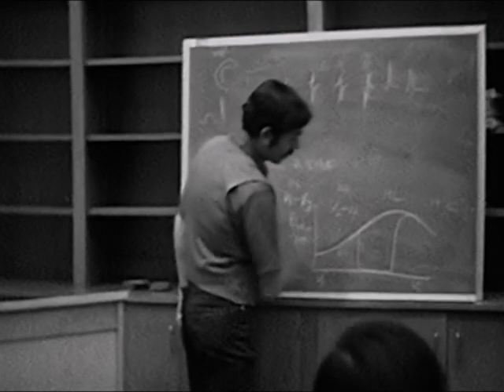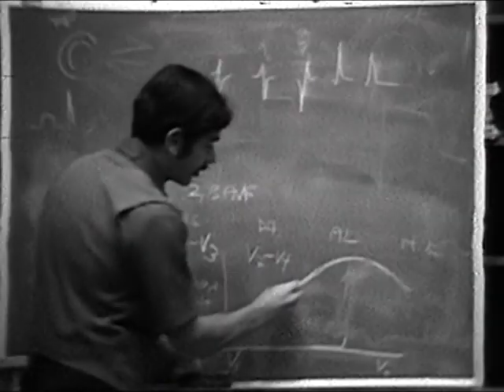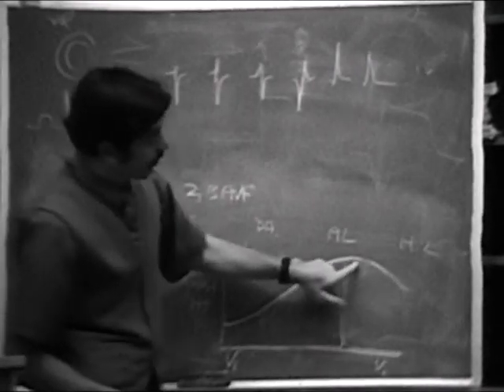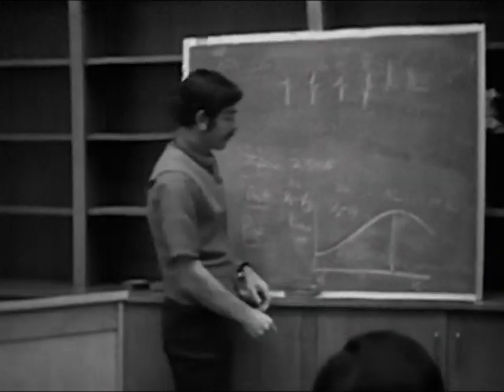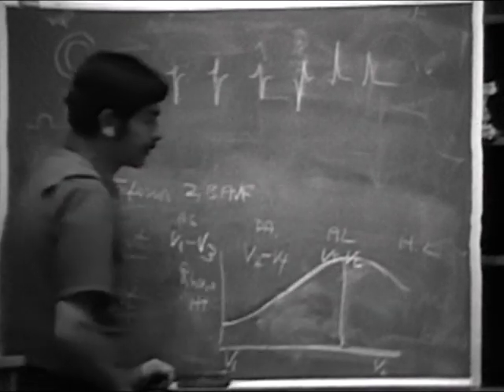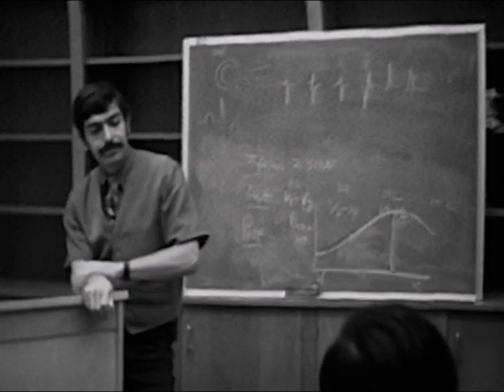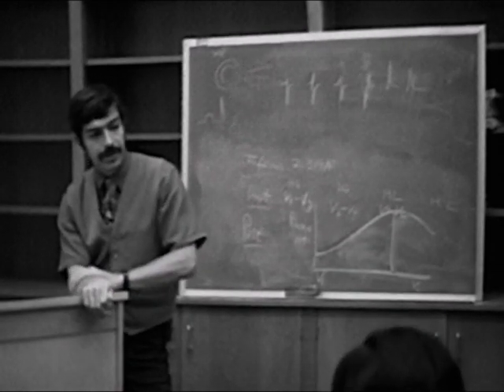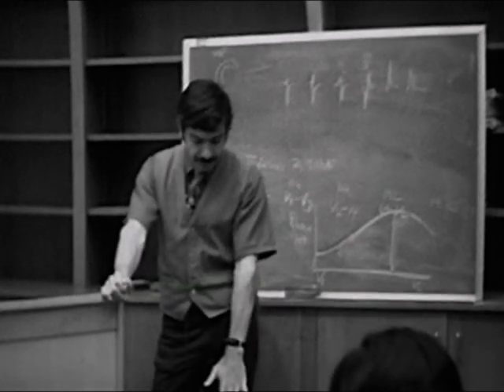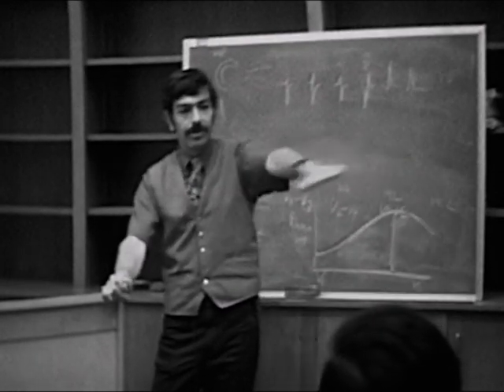And then with a lateral wall infarction, just carrying this out, I don't think I have to re-diagram this entirely. You'll develop deep Qs laterally. You lose your normal R wave progression out in V5 and V6. So anterolateral will be V5 and V6. Okay. Now, when you're looking at an inferior wall infarction, you see your changes in the leads down here. When you're looking at an anterior wall infarction, you see the changes across the anterior wall.